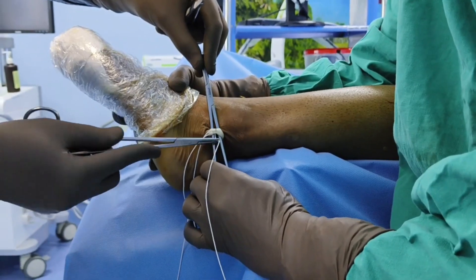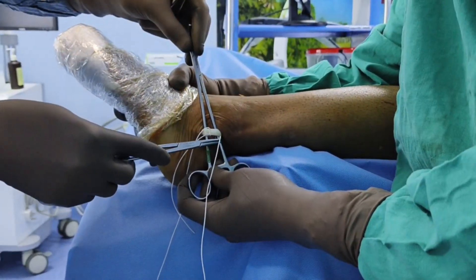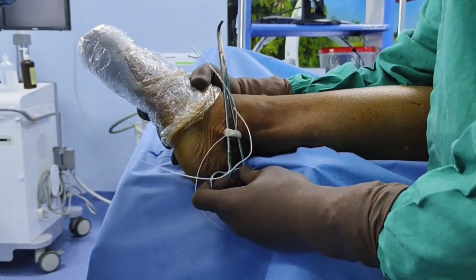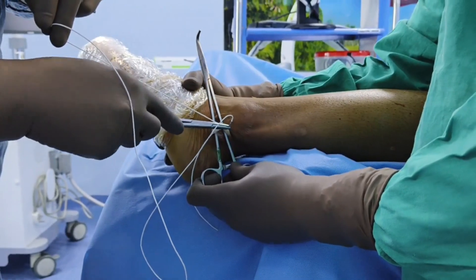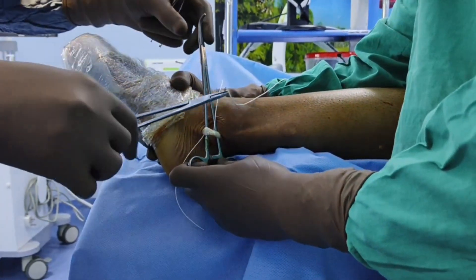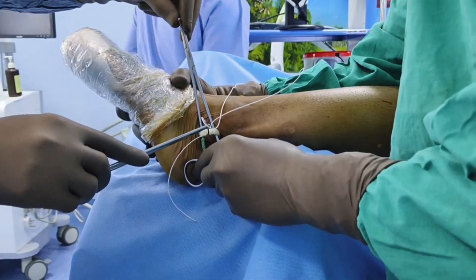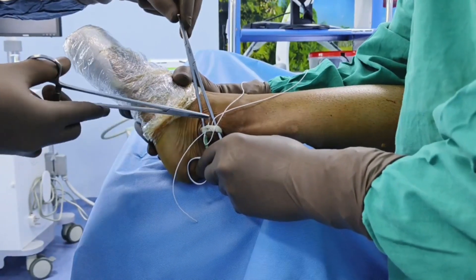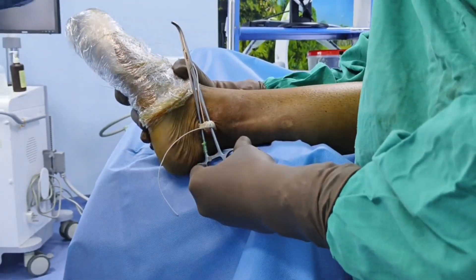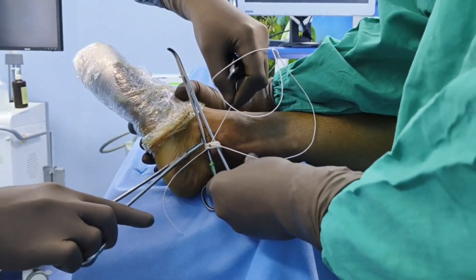Take multiple stitches or bites into the tendon — insert the needle from one end and take it out from the middle. You have to take at least two to three stitches this way, then pass the suture to the other side. On the anterior side, similarly pass it through the middle of the tendon and take it out from one end, taking at least two to three stitches. On the last stitch, pass the needle through the middle of the tendon and take it out from the distal end.